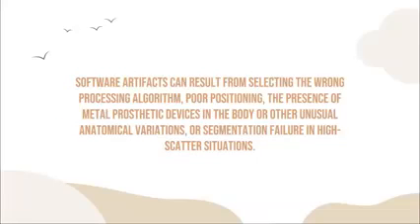Software artifacts can result from selecting the wrong processing algorithm, wala ka kabalo kung kanino ka magamit og interpolation or flat fielding, poor positioning, wala na center ang pasyente, the presence of metal prosthetic devices in the body such as braces, mga titanium na mga bakal, and other unusual anatomical variations or segmentation failure in high scatter situations. So muna siya ang mga software artifacts causes.